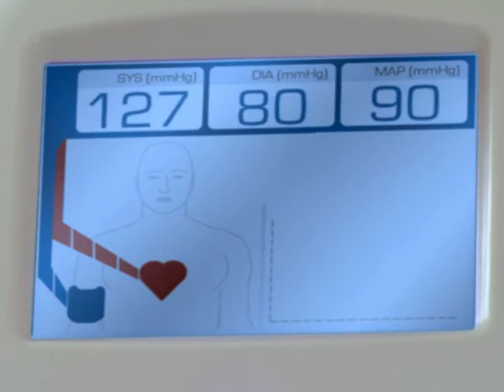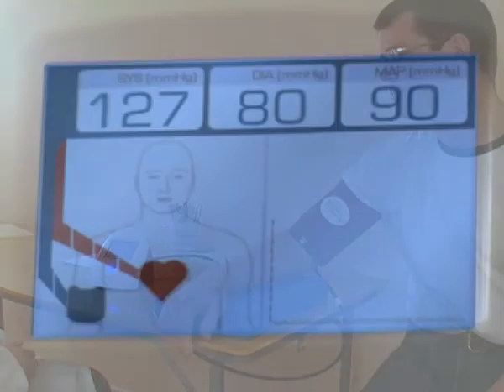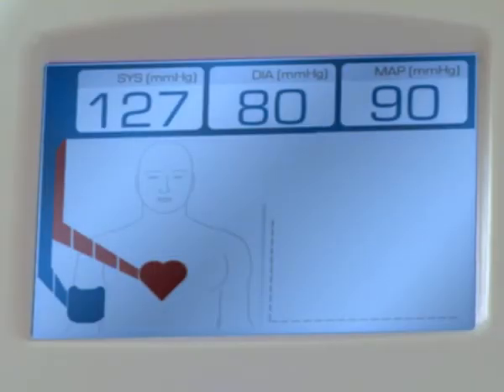A brachial artery pressure waveform is recorded whilst the cuff is inflated and also displayed. Central systolic blood pressure is calculated from this waveform and the results displayed in the red box.